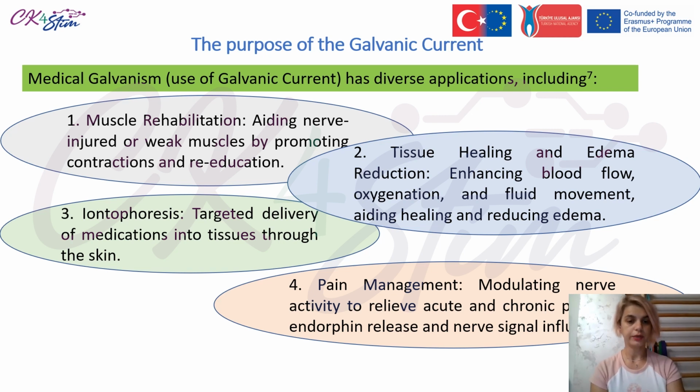By delivering a controlled current, it helps activate motor nerves and promote muscle contraction, facilitating muscle re-education and strengthening.